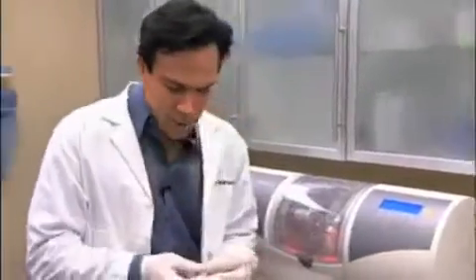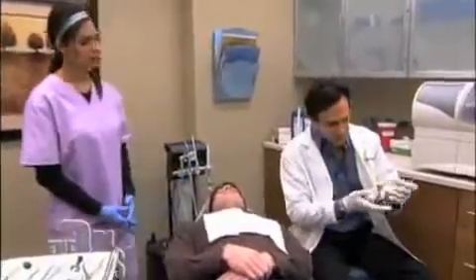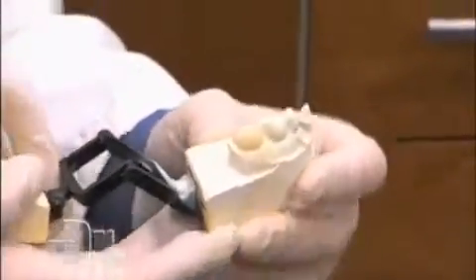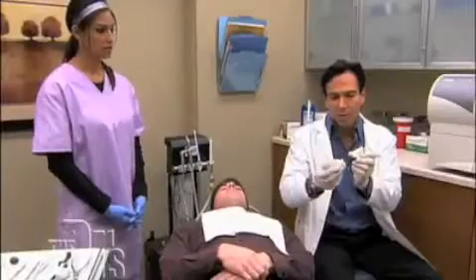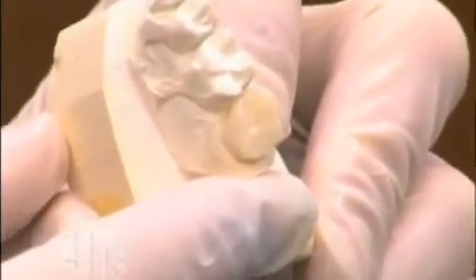Do you think this technology will be available in a lot of dentists' offices? It's starting to become more and more popular. Here's the crown now. Let me show you how this works. This is a replica of Kevin's mouth, and here's the porcelain crown that we just made. You'll see that this crown fits right on the margin, right on the model, and it is actually a perfect replica of what Kevin's tooth was before. That's fantastic — that's cool.